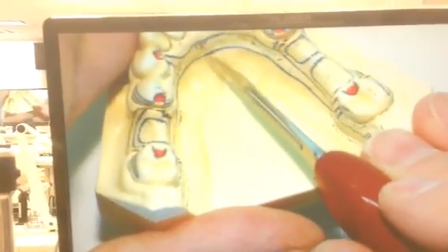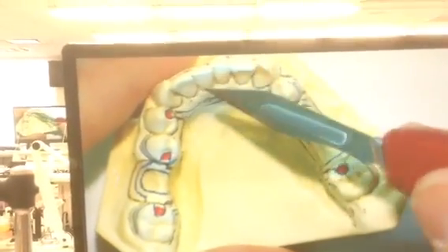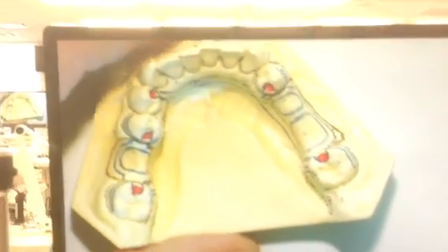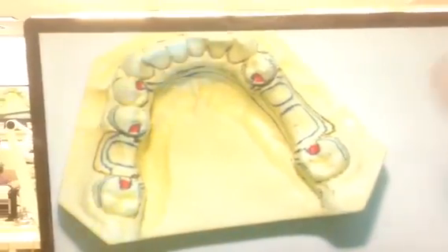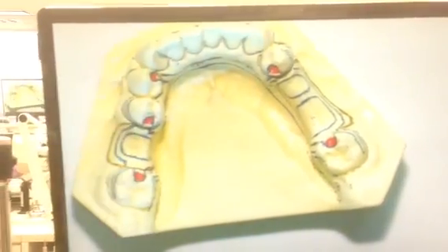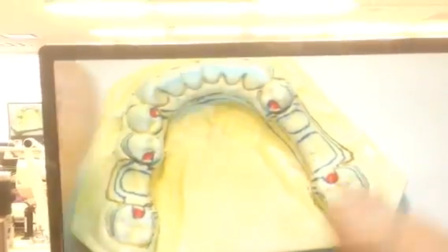Again, they used the lingual bar here. Could they have come up here and done a lingual plate? Nothing wrong with that. In this case, for a class 3, it might have been a little bulky for the patient, so I might not do that as much in clinical practice, but on the test it's going to be a lot easier for me.